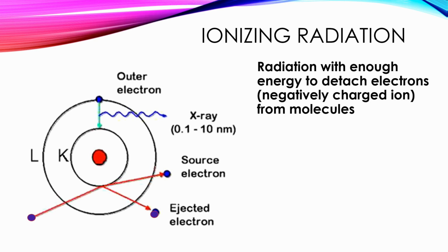So we're trying to figure out, where is this ionizing radiation coming from? Where is this lone electron that has come flying over to the ejected one from the molecule? Where did it come from? To figure that out, we need to look inside the tube head.